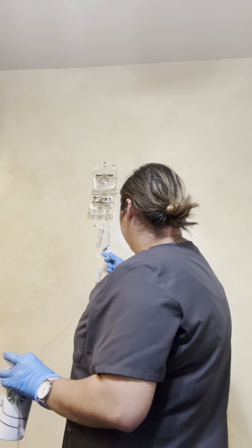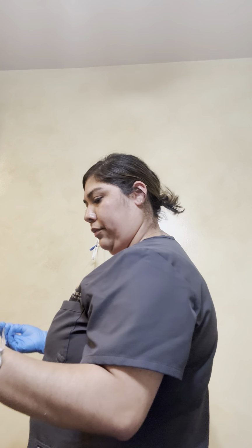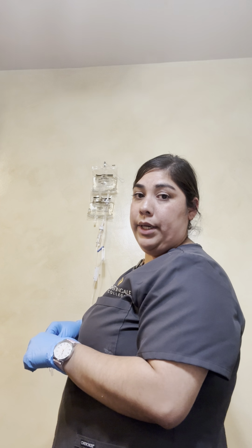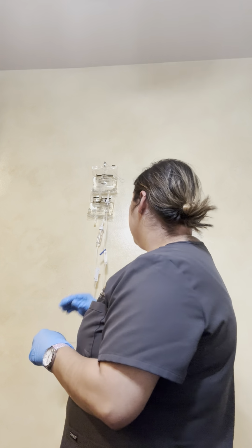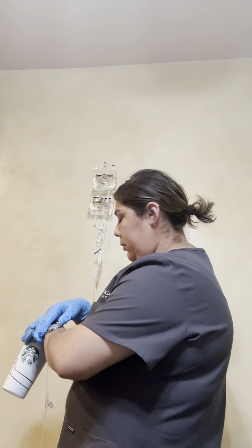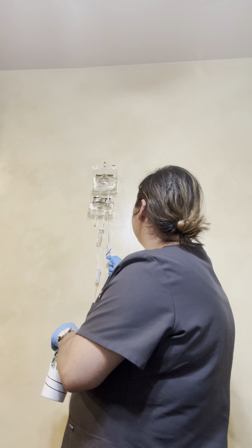Very good. And so now I'm actually going to want to calculate this. And this one has to be 100 drops per minute. So we're going to be verifying the full minute with this one as well. This one has to go a little faster.